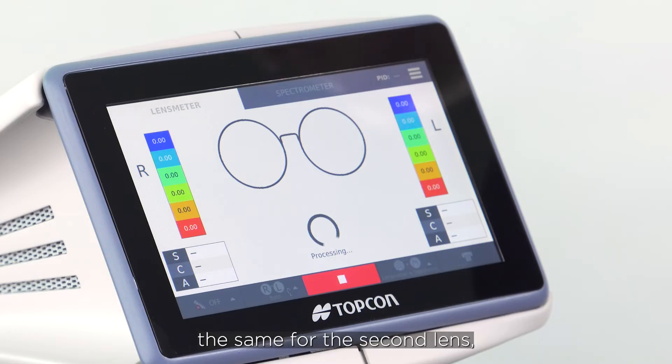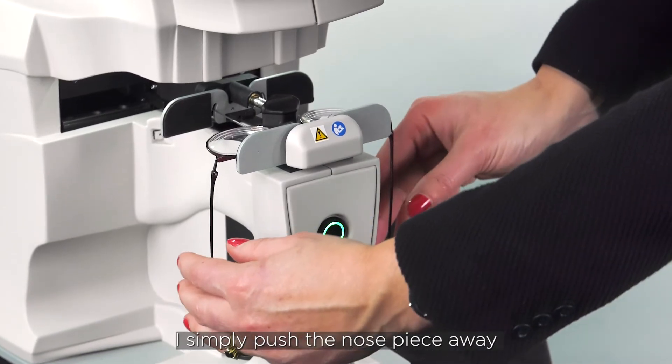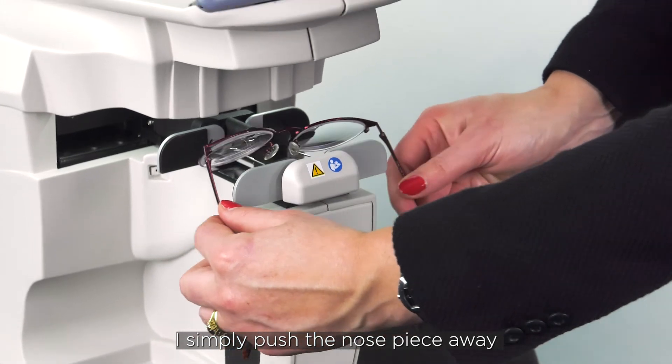Then it moves on to do exactly the same for the second lens. With the Solos back in its starting position and the frame supports released, I simply push the nose piece away and lift gently out.